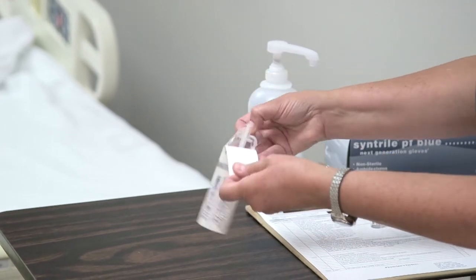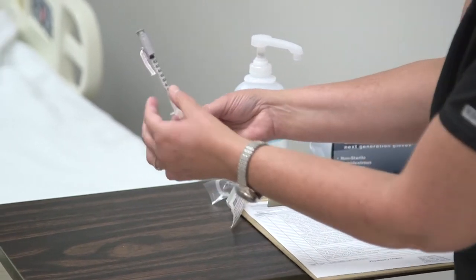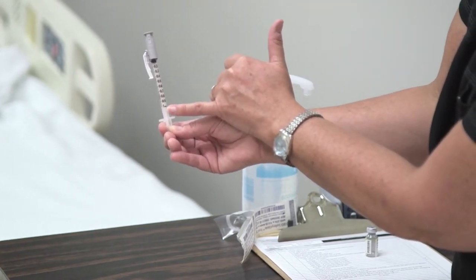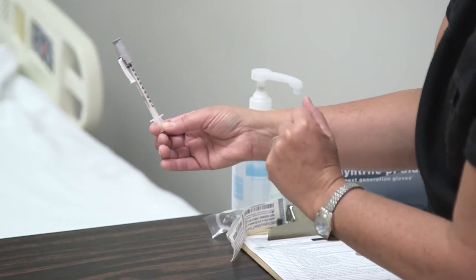Now I'm going to open it so you can see what the actual syringe looks like. You can see that one milliliter is the total dose, going from zero to the 0.1 increments up to one milliliter. This is a very small syringe.